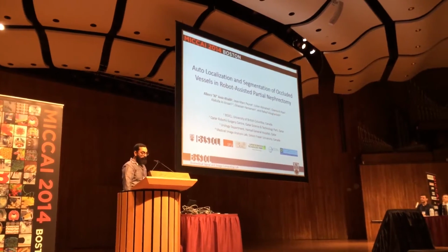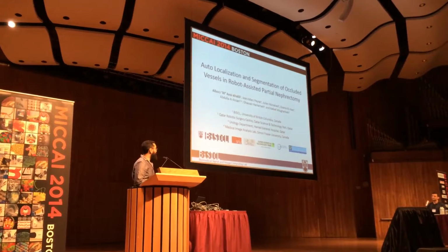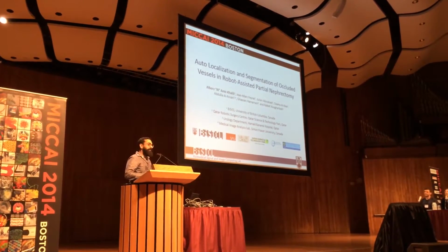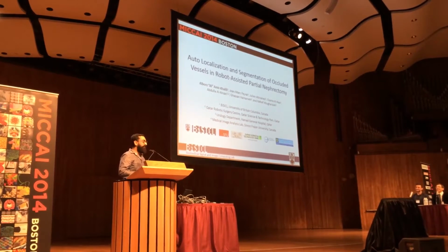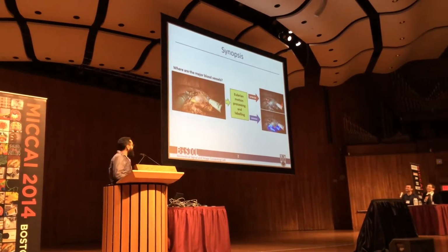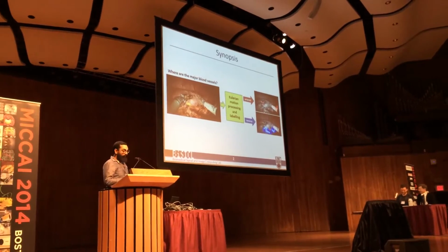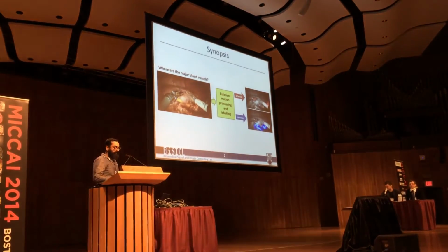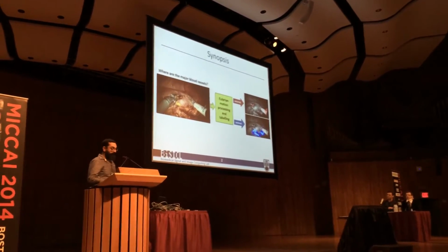Everyone, I will be presenting to you our method for locating vasculature from endoscopic video. Since we just had lunch, I am compelled to tell you that this presentation will contain some graphic surgical video. In essence, by analyzing subpixel motion or flow in endoscopic video sequences, our proposed method can detect pulsating blood vessels even when they're hidden under layers of fat.